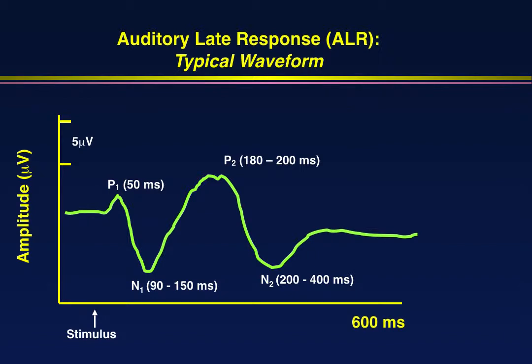This is actually a rather easy response to record. You can record it with an ABR system, and it's large. The typical amplitude will be 5 to 10 microvolts, so it's quite easy to detect. These are the main components.